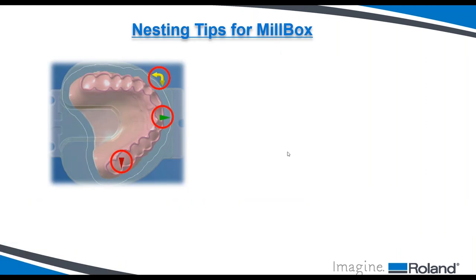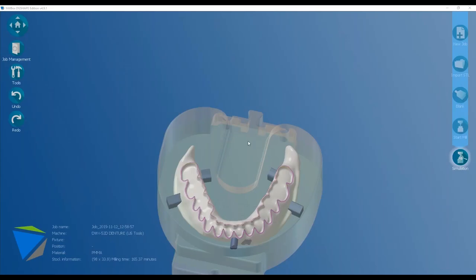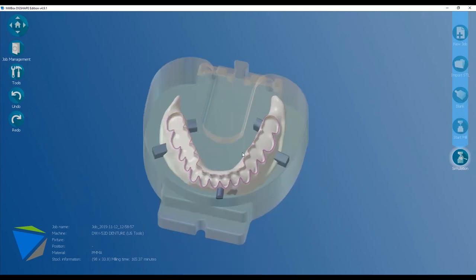Now I'll give a quick live demonstration of the nesting procedure in MillBox. I already see there are questions coming in, which I'll address right after. Here in MillBox you can see the final result — this denture has a milling time of 165 minutes, approximately two and a half hours. Now I'll start a brand new job and take you through the whole process from start to finish so you can see how simple it really is.